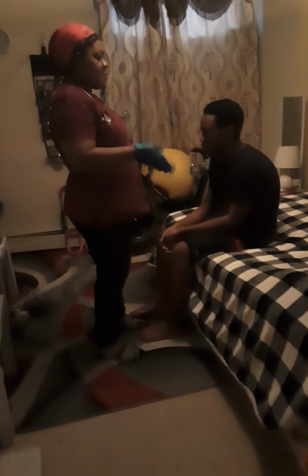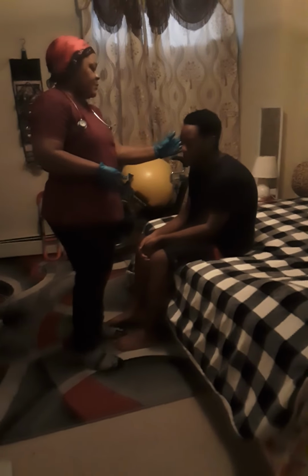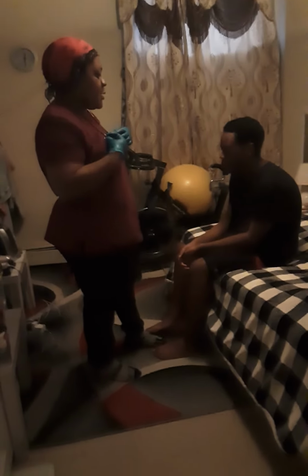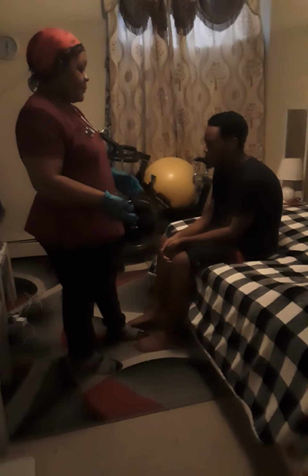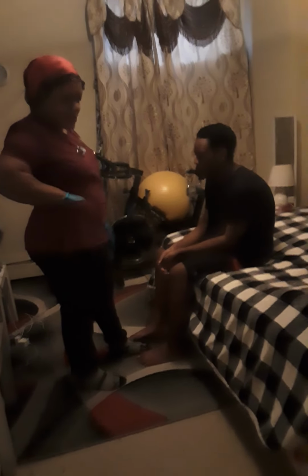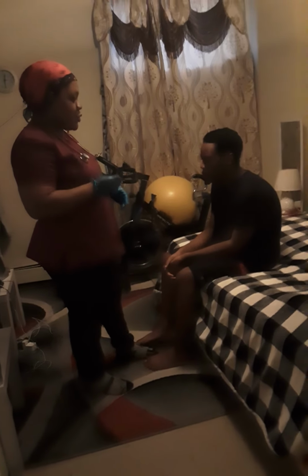Now we'll be doing the whisper test. I will cover one side of your ears and I will say 3 words and you're going to tell me what I said, okay? With your head straight. I love you. I love you. Okay, so the patient heard and repeated what I said. Now we will proceed to do the otoscopic examination. We're going to use the otoscope.